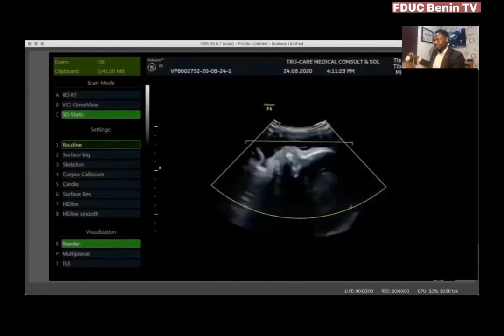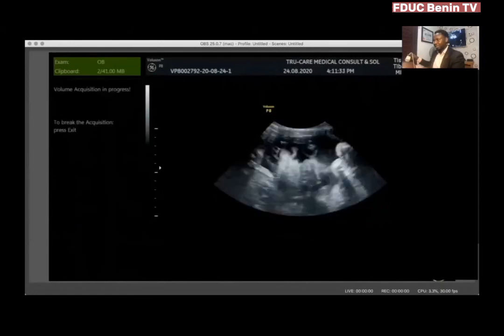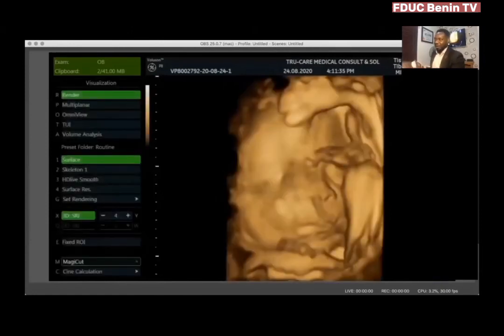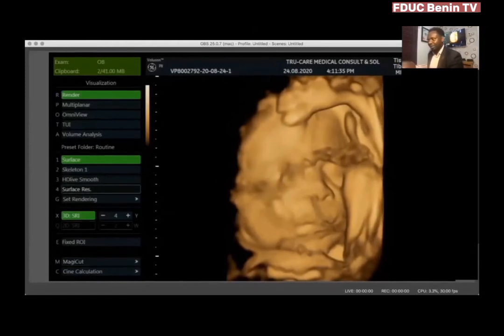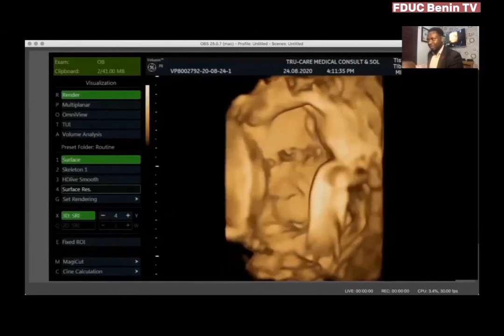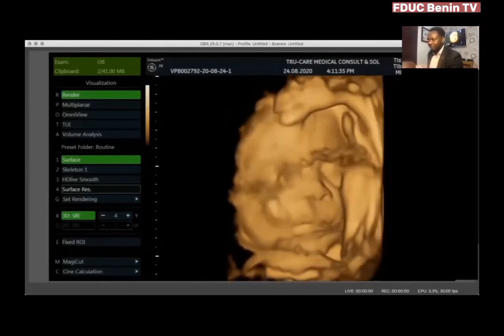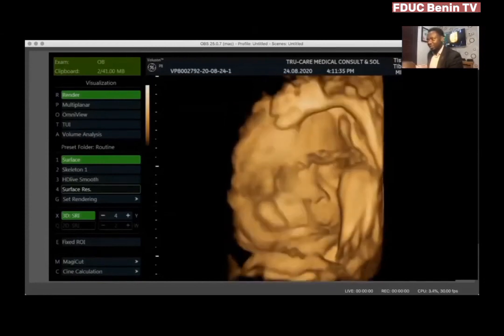So we have the baby coming a little towards, I'm trying not to go against what Aya said. Let me not go too much into the uterus. Now, I'm going to do something deliberately on this image. You see that we see part of the nose is here, but we can't see a lot of things. So depending on what we said, for example, I begin to sometimes rotate to see, okay, at what point can I get some parts to cut out?